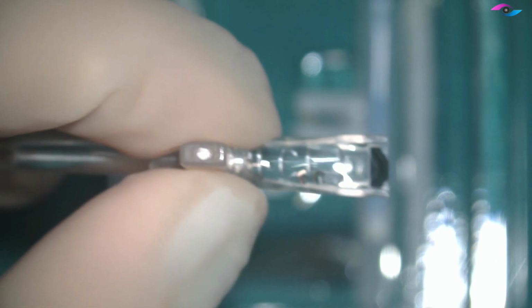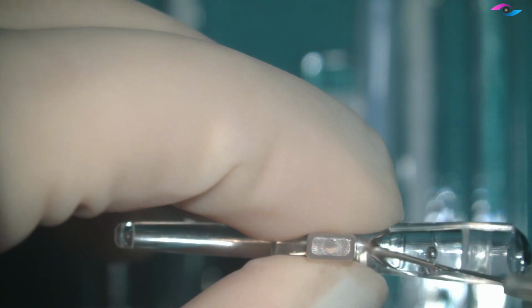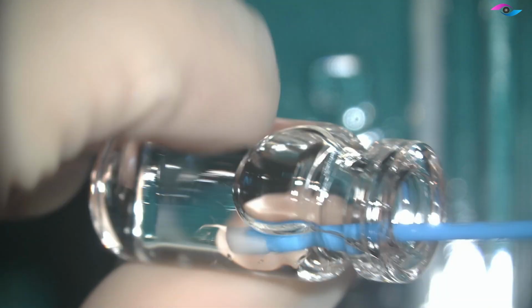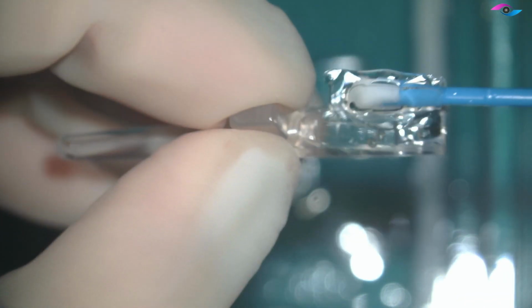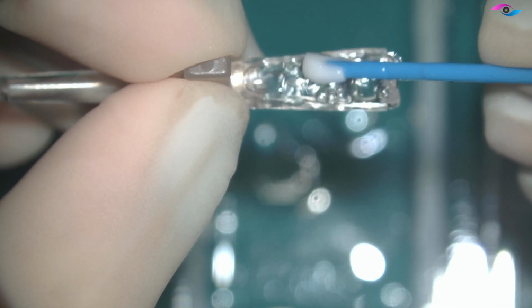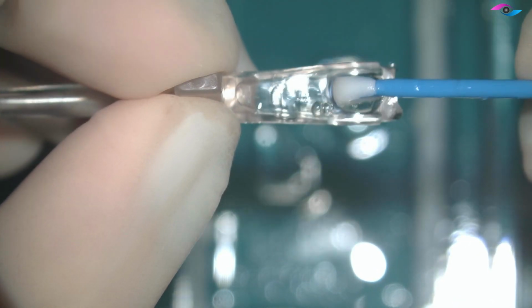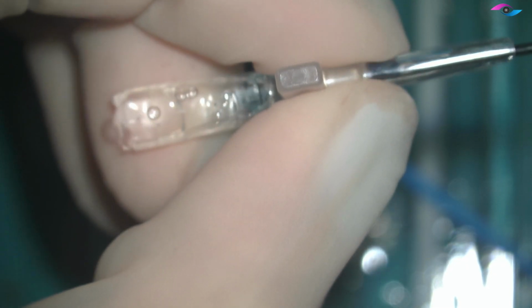Here we are in the cartridge using a combination of a dispersive viscoelastic along with BSS, and then we are removing the lens from the bottle with the help of a special sponge tip applicator which comes with the ICL. As the ICL is very delicate, this is what is recommended to handle it, instead of using McPherson's forceps or IOL holding forceps.